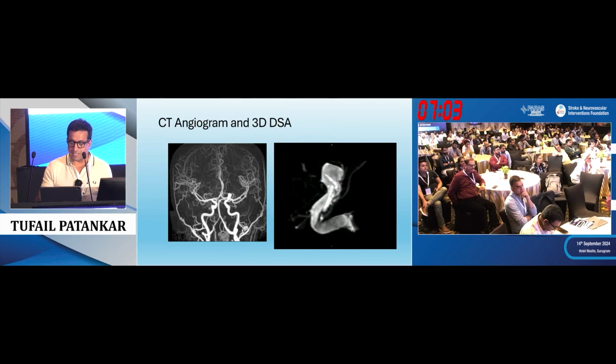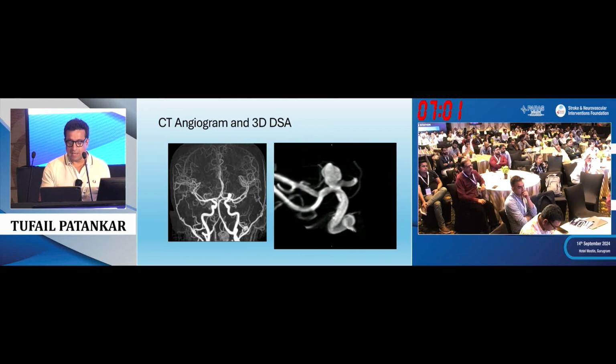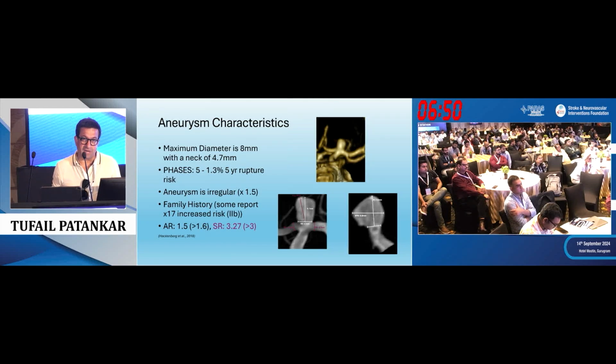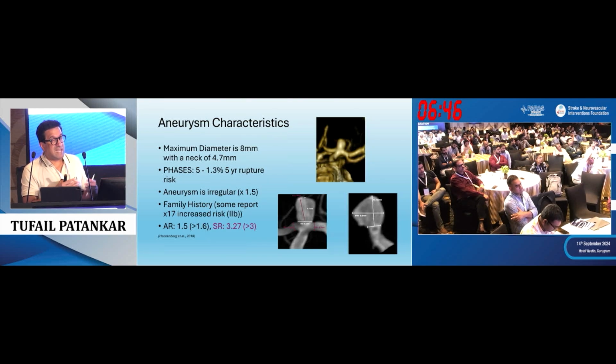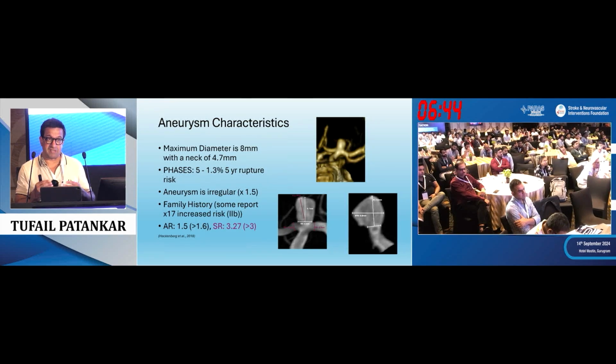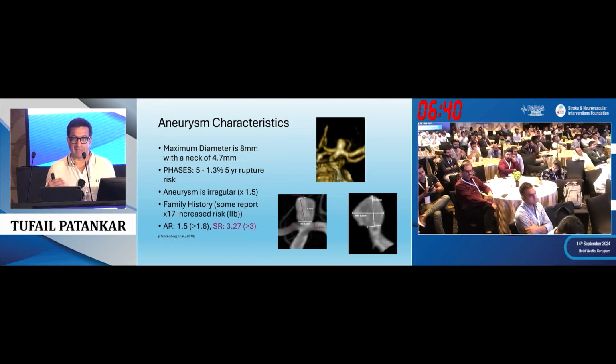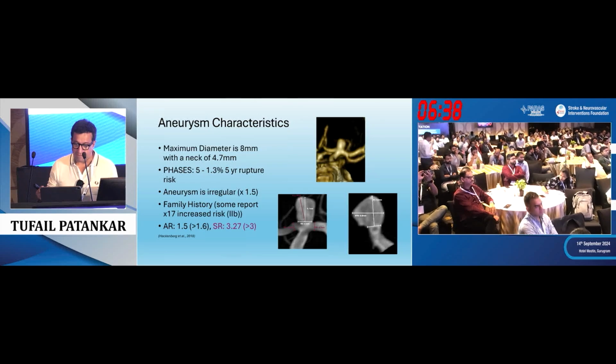You usually have a CTA or MRA, and you look at the dimensions on the CTA, MRA. Again, it will tell you. Again, I don't use WEB now in large aneurysms because I know the recurrence rates are very high. Whereas you should not be worried about putting in a less than 9 millimeter. I think the recurrence rate are a lot lower. 9, 10, 11 millimeter up, I think the recurrence rate of WEBs are different and higher.